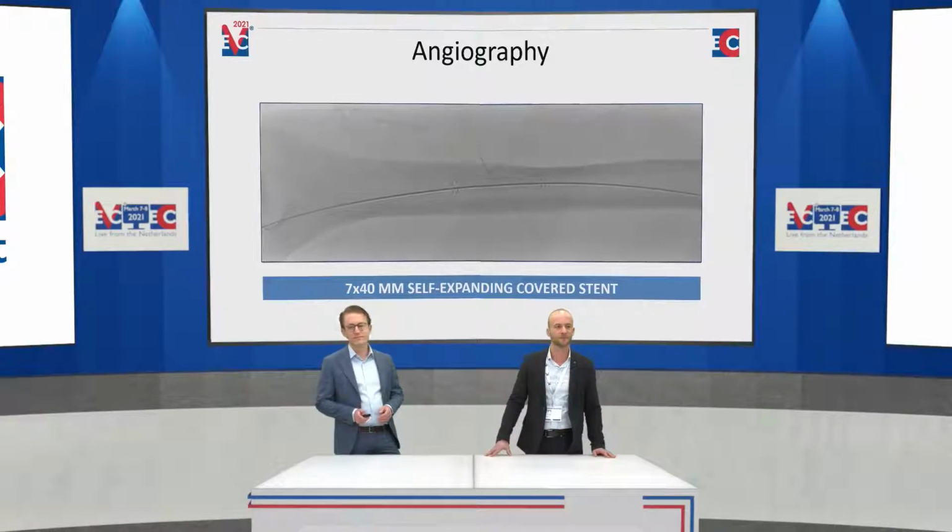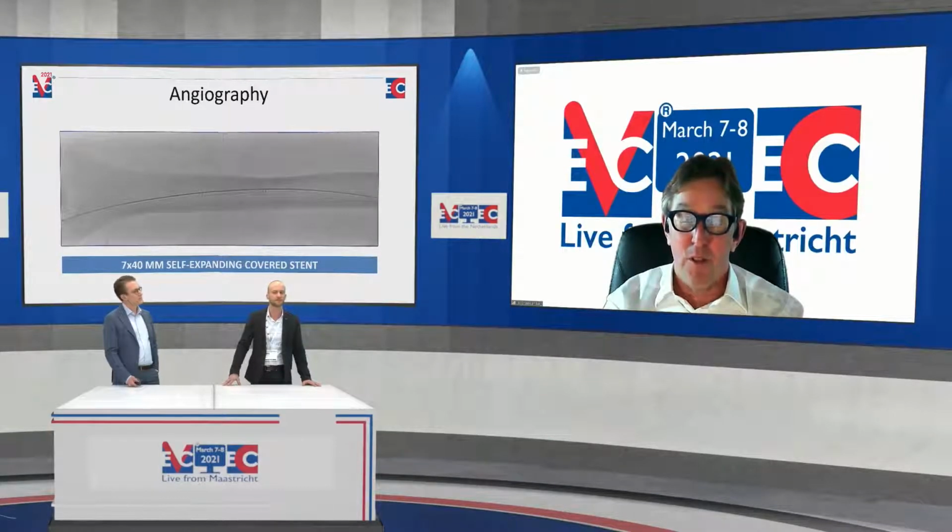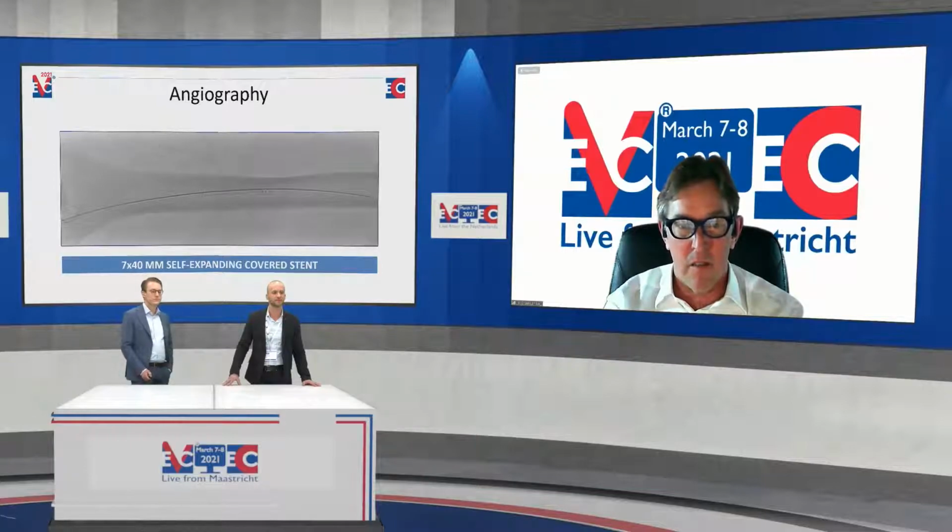Would you consider a non-covered stent in a case like this? You see reduction of the bleeding already, but you obviously have a residual stenosis that needs to be treated. Otherwise, the patient will not go away from the angio suite with a treated AV fistula problem.